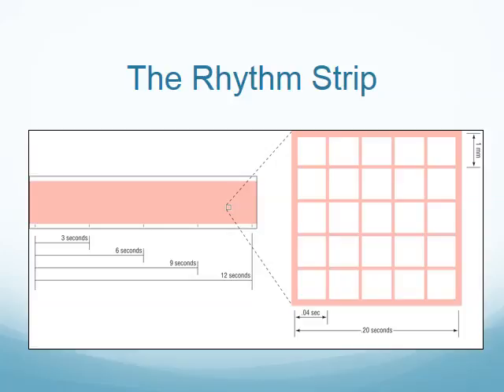At the beginning, I believe I have a picture of it later on. If not, we'll look at some. Anytime that you do an EKG, at the very beginning when you start printing out your strip, you'll see 2 small rectangular boxes on each lead. What this is, is a calibration box. This should be printed on every EKG that you print off. If it's not printed on there, then you really can't trust your EKG, because what that machine is doing is calibrating to the boxes to make sure that it's printing correctly.